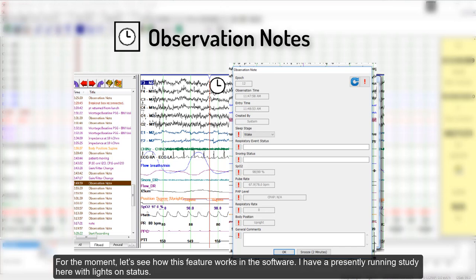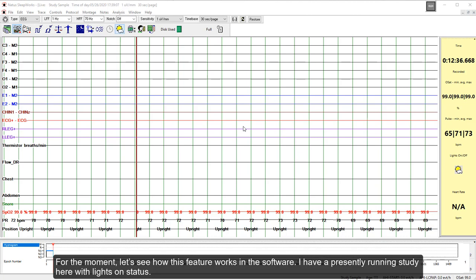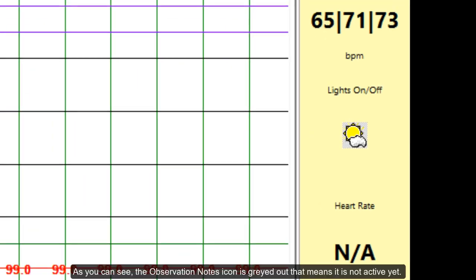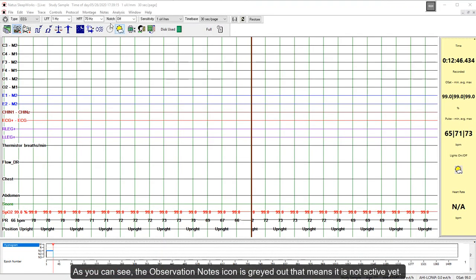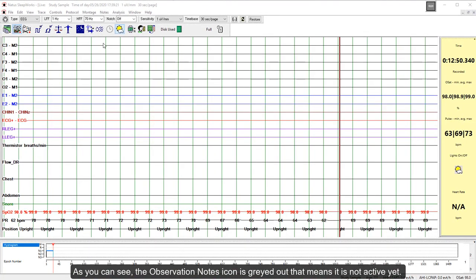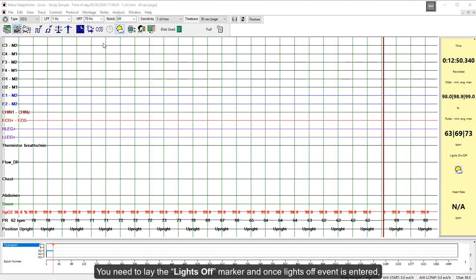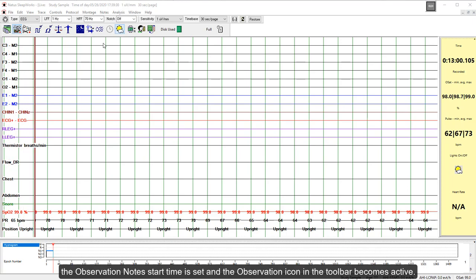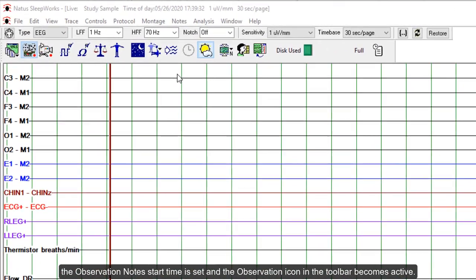Let's see how this feature works in the software. I have a presently running study here with Lights On status. As you can see, the Observation Notes icon is greyed out, meaning it is not active yet. You need to lay the Lights Off marker, and once the Lights Off event is entered, the Observation Notes start time is set and the Observation icon in the toolbar becomes active.